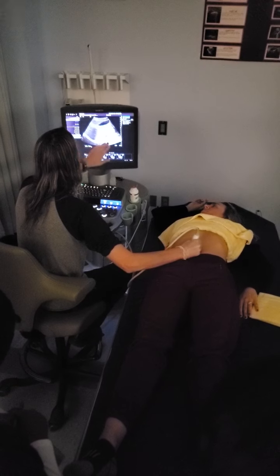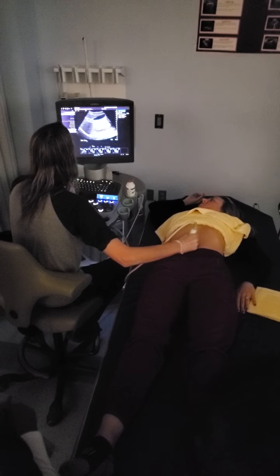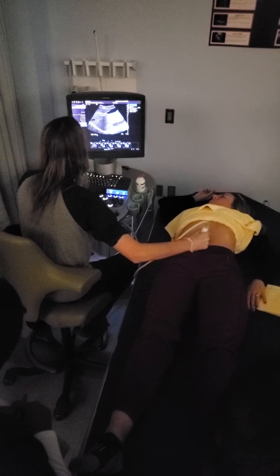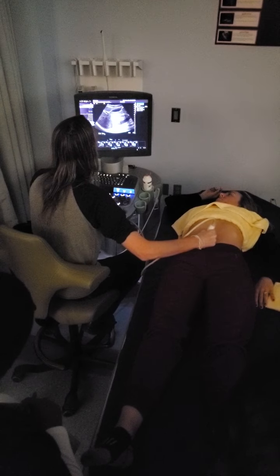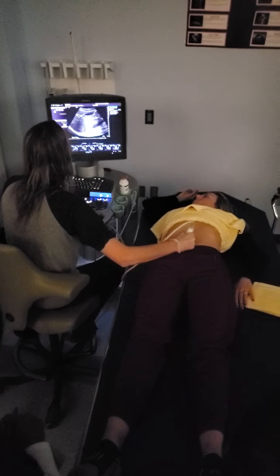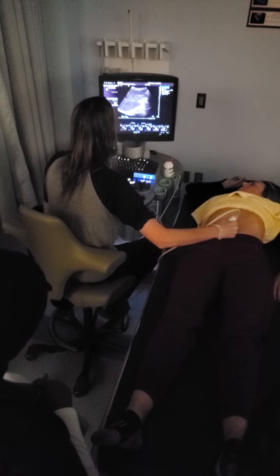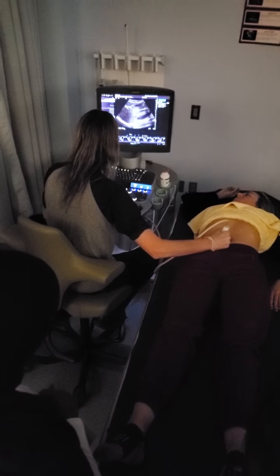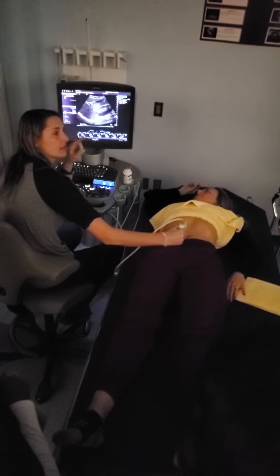So we've got that diaphragm, so we want to make sure we have enough depth to evaluate for pleural effusion, and a little bit more right. We want to make sure we have that inferior border being shown. So we've got our medial, our mid, and our lateral. Now, oh my gosh, we end right here at Morrison's pouch. That is so weird. Why do I care? Ascites?